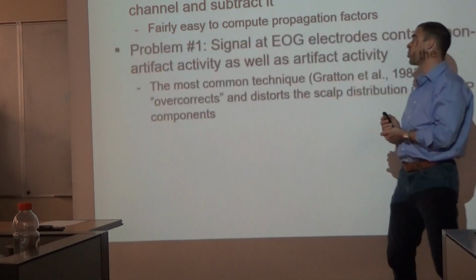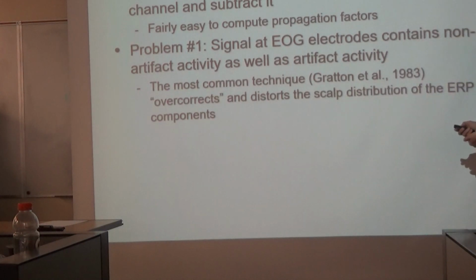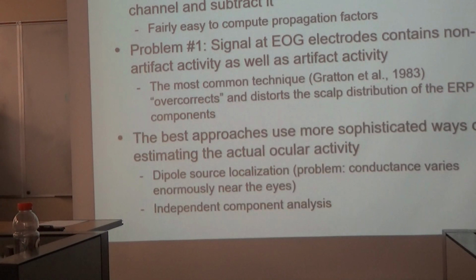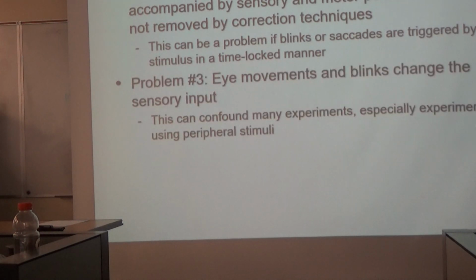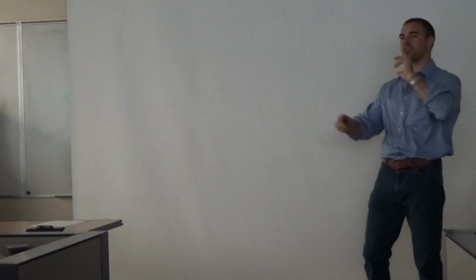So the way that that's basically going to work, let me see if I can skip through a couple of these things here. Well, what I wanted to basically do is keep it simple and just introduce the idea that with ICA, you're subtracting that information out.